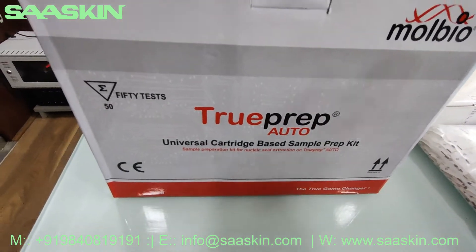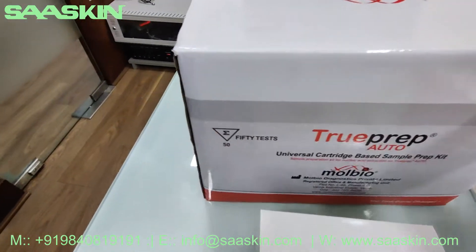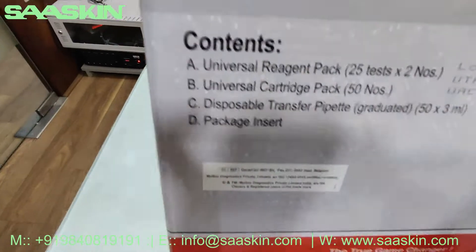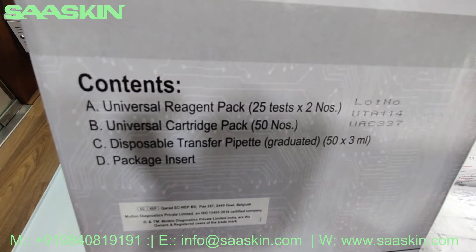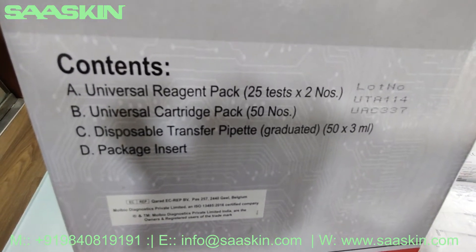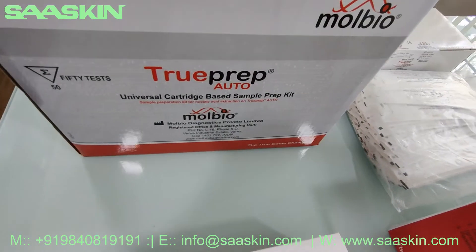Here is the main universal cartridge-based sample preparation kit. This is how the box looks like. The contents of the box include a universal reagent pack 25 x 2, a universal cartridge pack 50 numbers, disposable transfer pipette 50, 3 ml type, and a pack insert. This is the universal cartridge sample preparation kit.